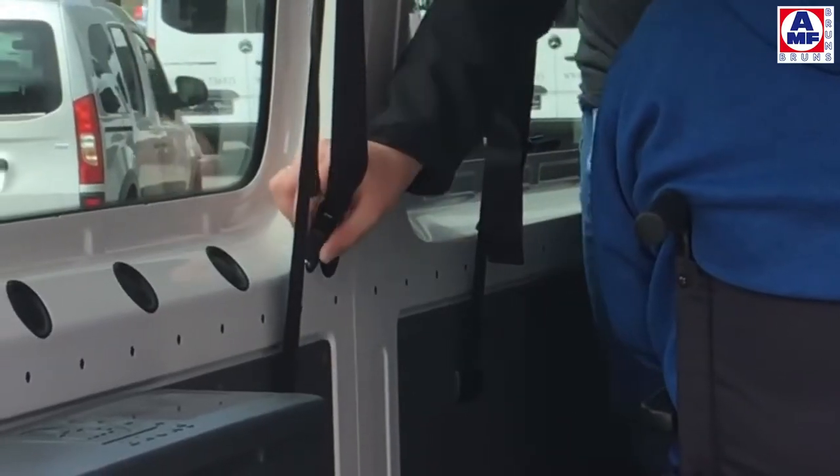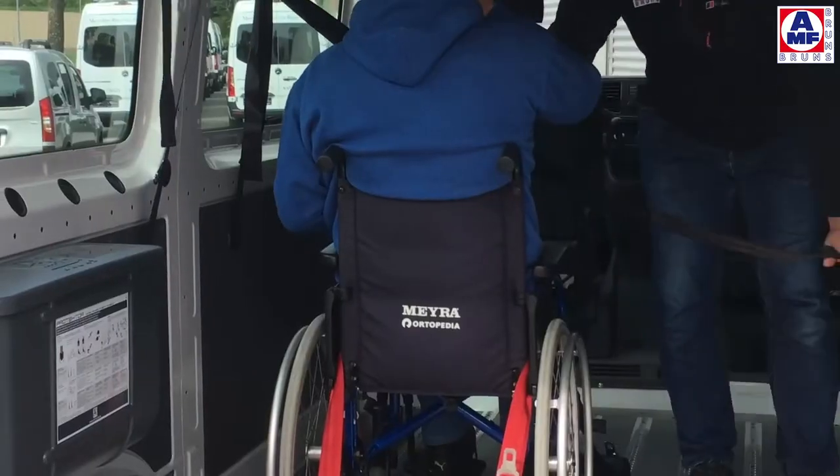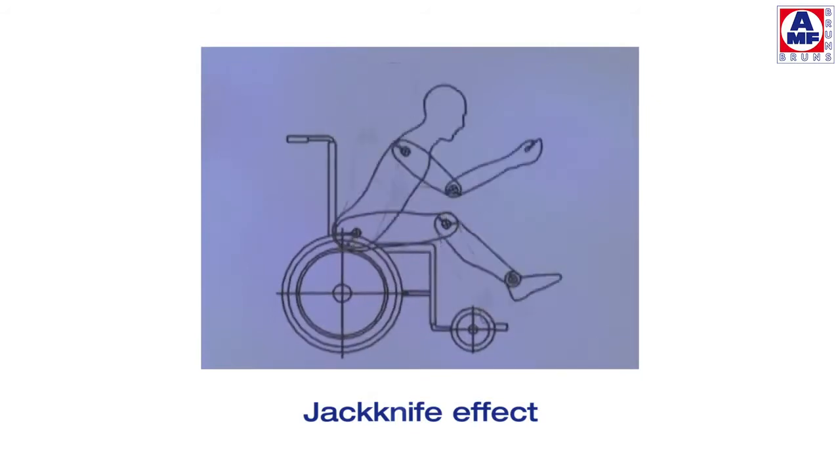The shoulder belt needs to be tightened well and should cross the shoulder right in the centre. In the event of an accident, this is the only way to avoid a jackknife effect which leads to serious injuries.